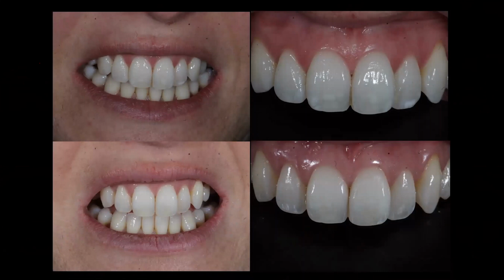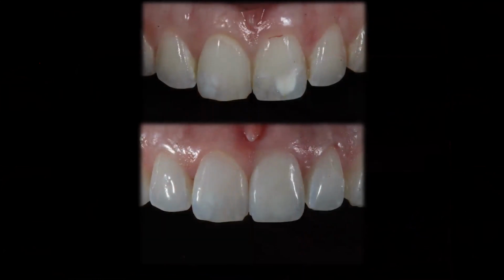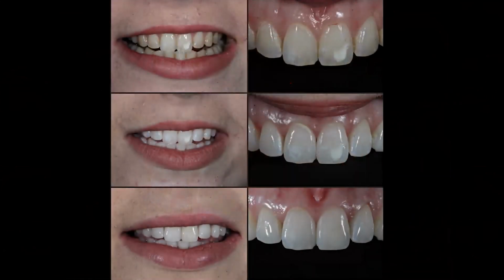And there we are. So that's the before and after for her, and she's quite happy with that, which is good. And as I say, for these sorts of cases, where you've got quite a deep defined lesion, I think it's good to whiten first. You may remove some of this yellow around here. You may improve the contrast between the actual enamel and the tooth, and she could do with a bit of a prophy as well. So she went to see the hygienist, this patient. Then she had some whitening. And then for this case, we actually did a combination again of Icon and a bit of microabrasion of the surface, and just restored that with a bit of composite resin there. And ended up with a lovely result for her there.